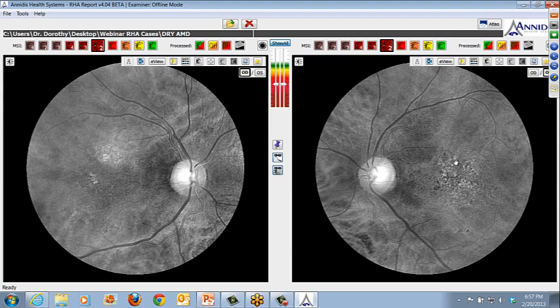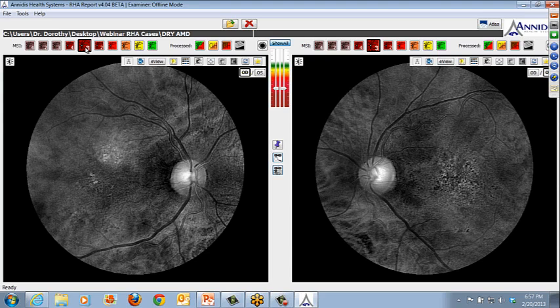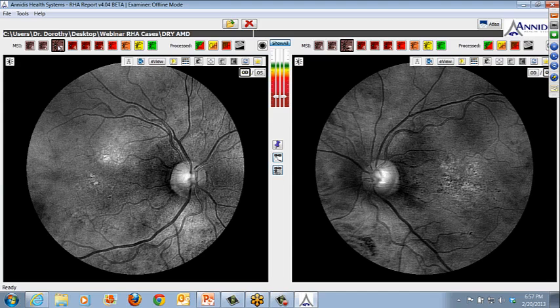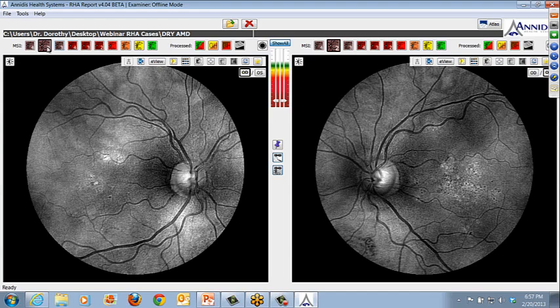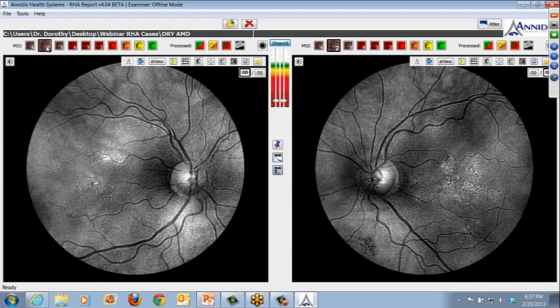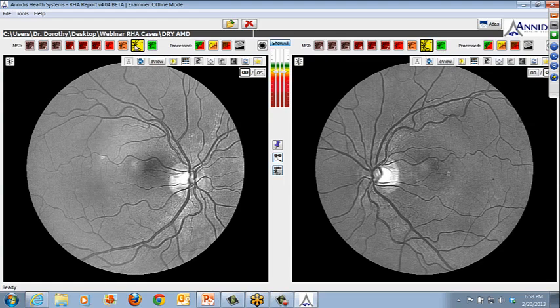You can see atrophy indicated by the patchy white areas where you're actually seeing down through past the RPE. And you'll see that most hyper-reflective on your red 3s and your red 4s. And as you get down into the choroid with the infrared images, you'll see that atrophy fade. Of course, this is pretty significant atrophy. It should give you a sense of how significant this particular patient's AMD is.